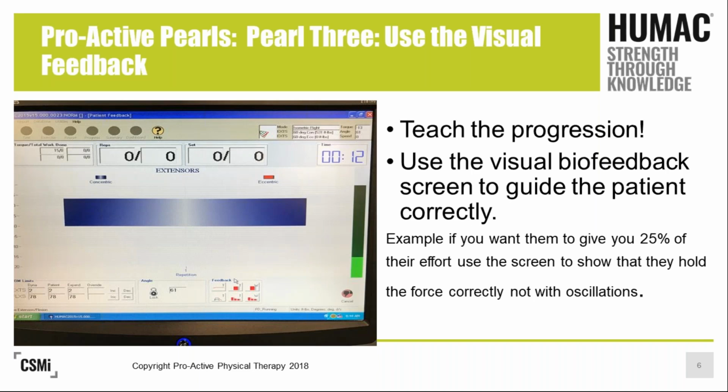And then when we're starting to talk to the patient, early on, I don't mind aligning 0 pounds to 0 pressure, 10 pounds to 10%, 20 pounds to 20%. But what I'll do is I'll have them push with 5 pounds of pressure in the very beginning. And I'll ask that individual patient, how much effort are you giving me? And I use that as my control guide to how far I'm going to take it.